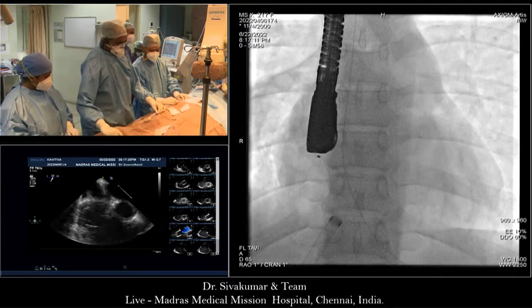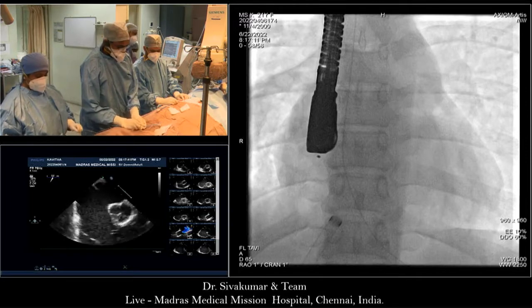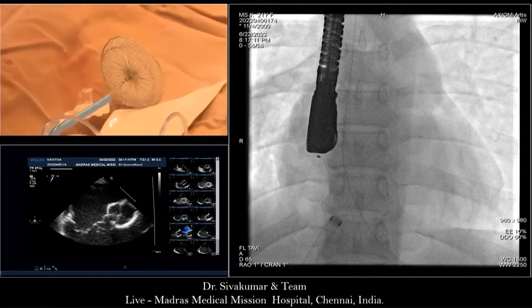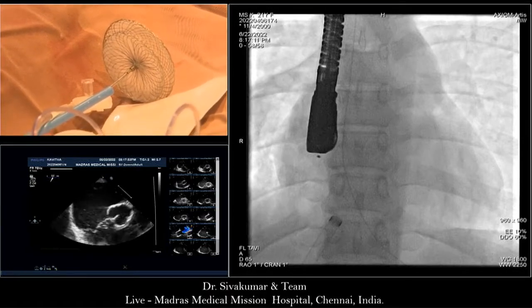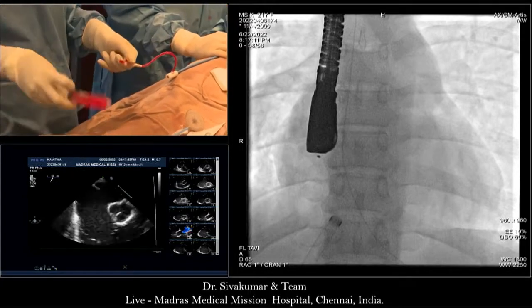We would do it prophylactic. Prophylactic? We'll not try any other technique? No, I think he's asking about pulmonary vein deployment. Which technique would you use if it doesn't work and continues to protrude? We would do a balloon assist. Balloon assisted technique? Who described that? Prophylactic means from the beginning. Yes, from the beginning, you put another wire.